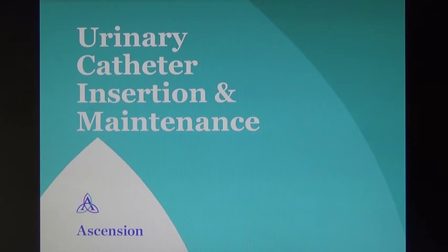Today we will discuss and demonstrate how to perform a urinary catheter insertion and subsequent maintenance care.